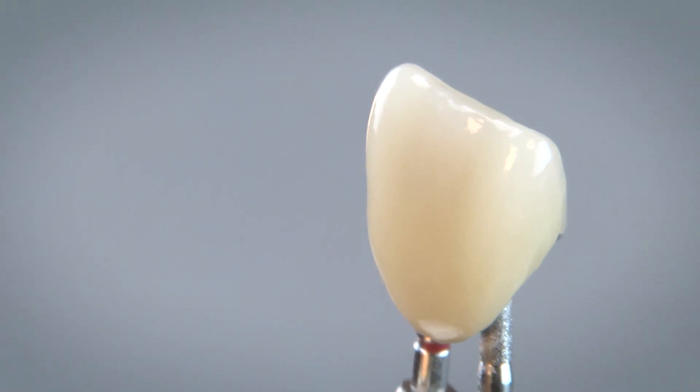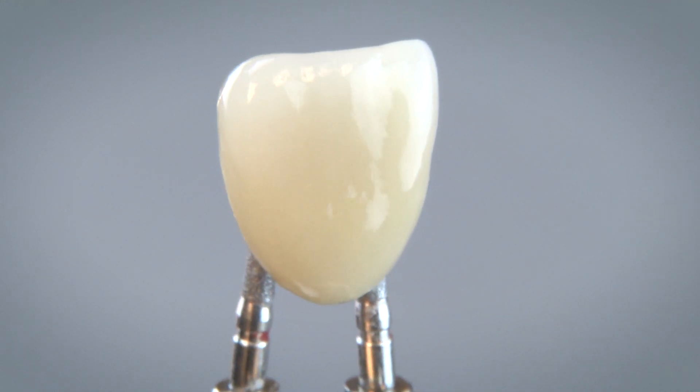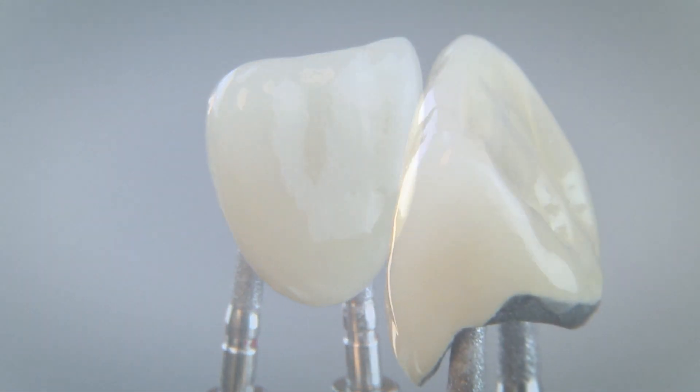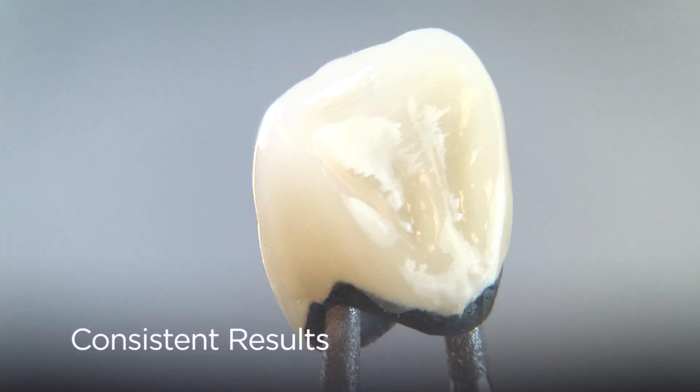Thanks to its proprietary source of high potassium feldspar ore, Ceramico 3 delivers incredible performance from its unique formulation. It is a forgiving ceramic system that gives each technician the freedom to work the way they are most familiar and comfortable with, allowing for better individual control.